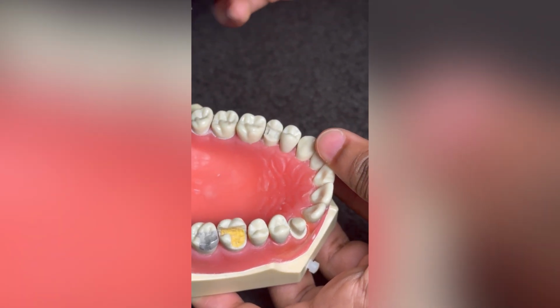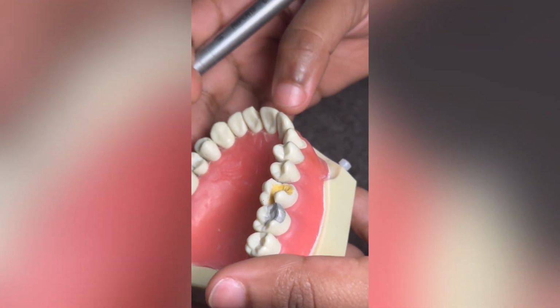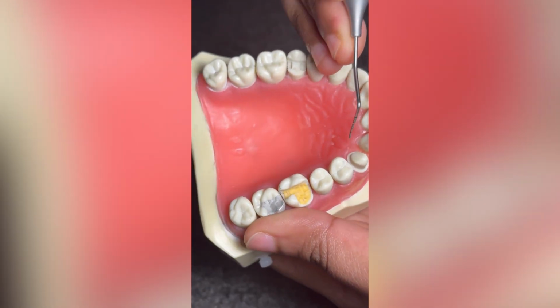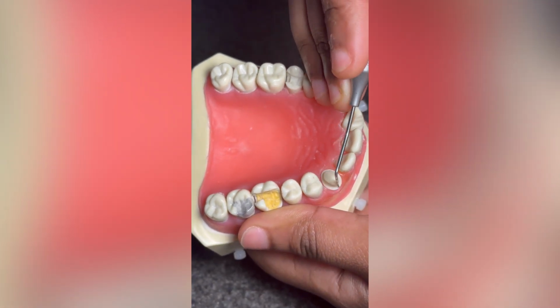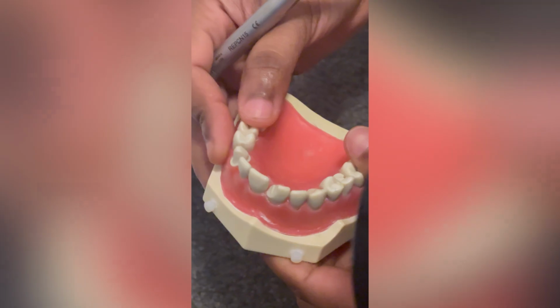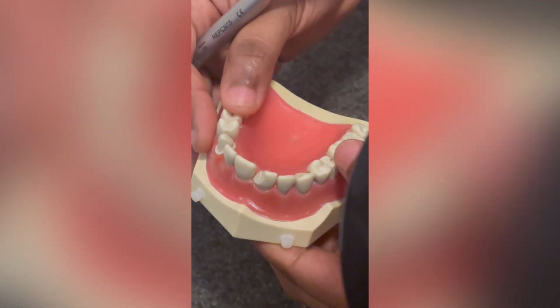Now the third criteria is margin form. The margin is smooth, continuous and identifiable. As you can see, it is smooth, continuous and identifiable. So that's fine. There is no roughness. So that's all our assessment done for today.